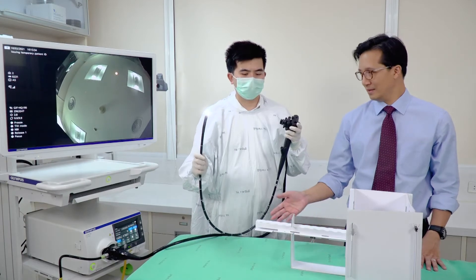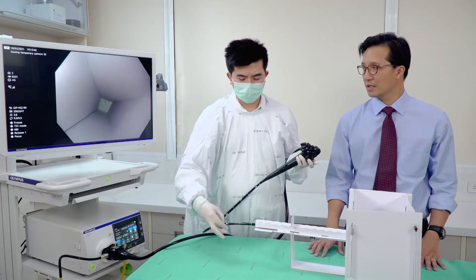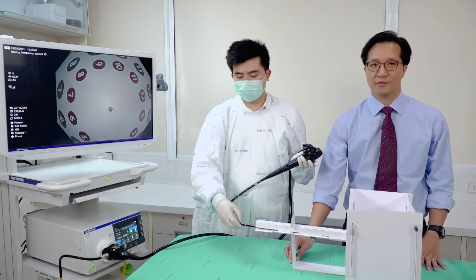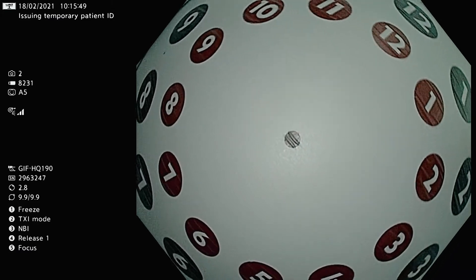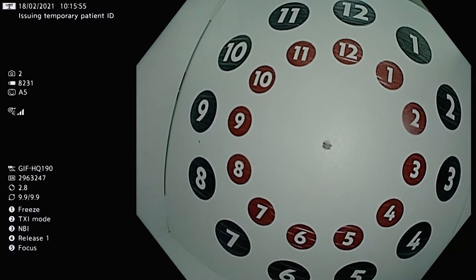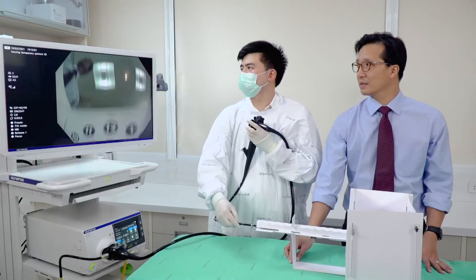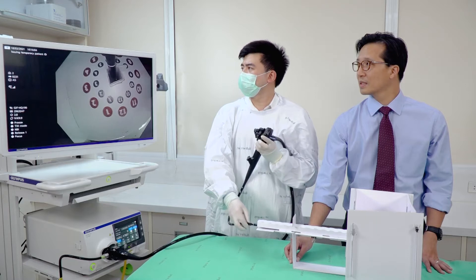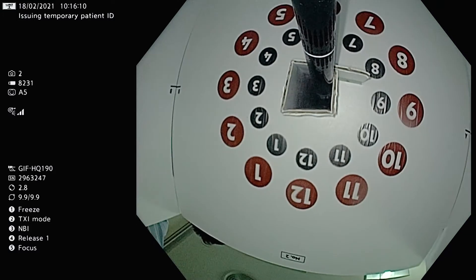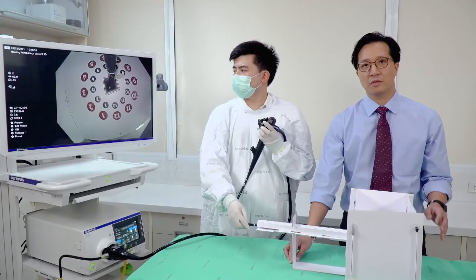I'll show you what the box looks like inside. This is the esophagus, then as you go into the box itself you see a ring of numbers — a clock face from 1 to 12. You have the red and black spots to train how acutely you want to bend the scope. Also on retroflexion there's another ring of numbers, so you can practice manipulating the endoscope in a retroflex fashion.